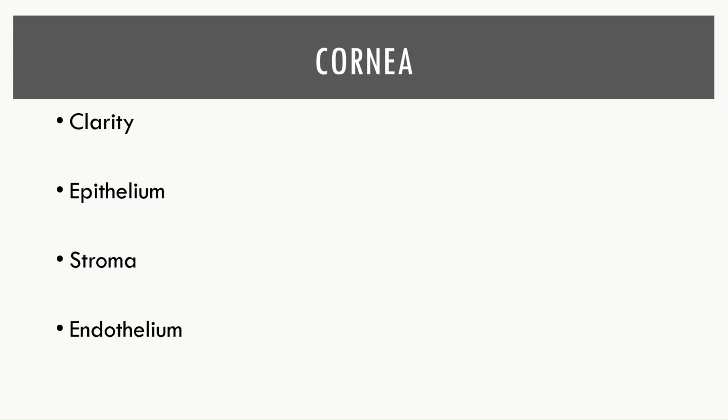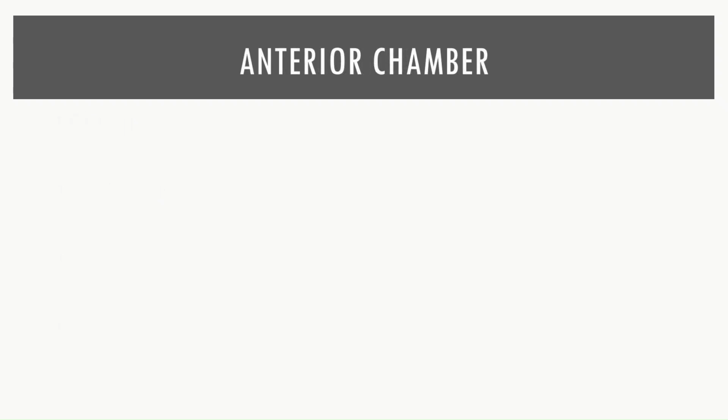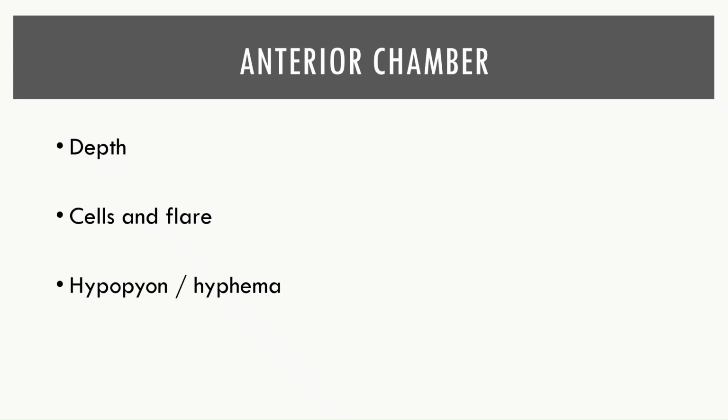Corneal examination includes assessment of clarity, each corneal layer, and the presence of deposits or scars. The anterior chamber is assessed for depth and inflammatory activity, including cells, flare, hypopyon, or hyphema.